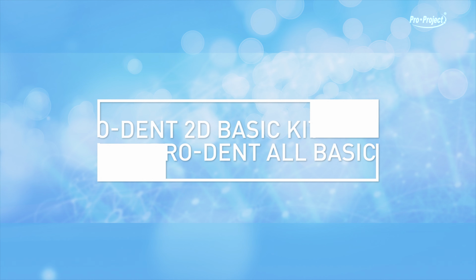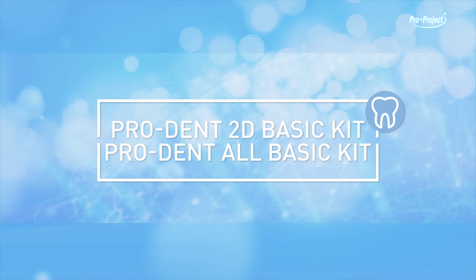Dental Radiography, Pro-Dent 2D Basic Kit, Pro-Dent All Basic Kit.